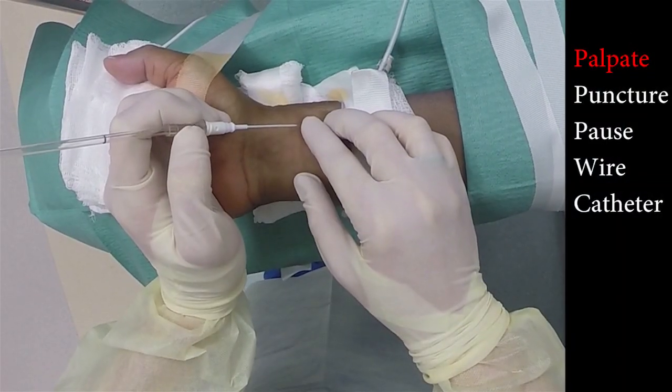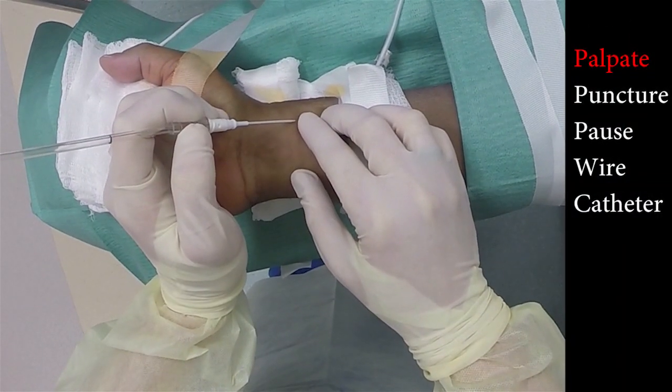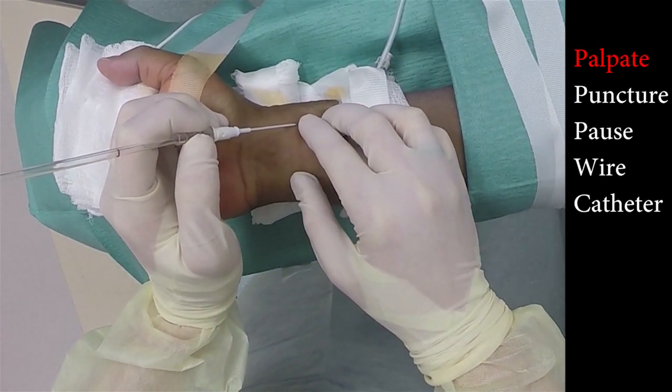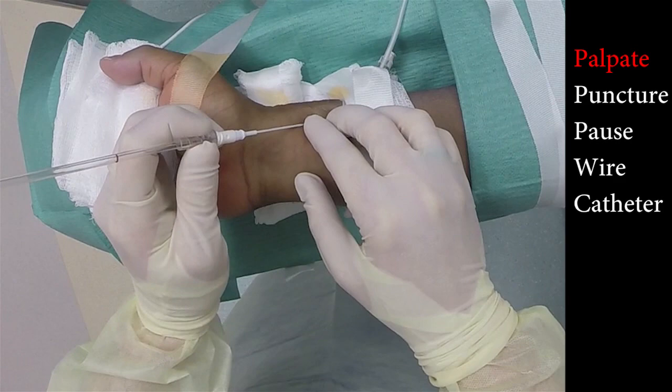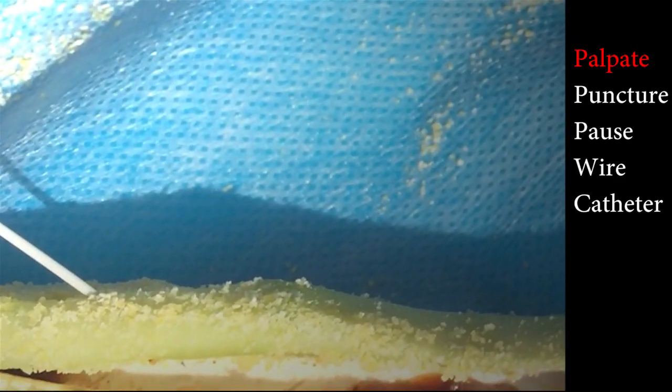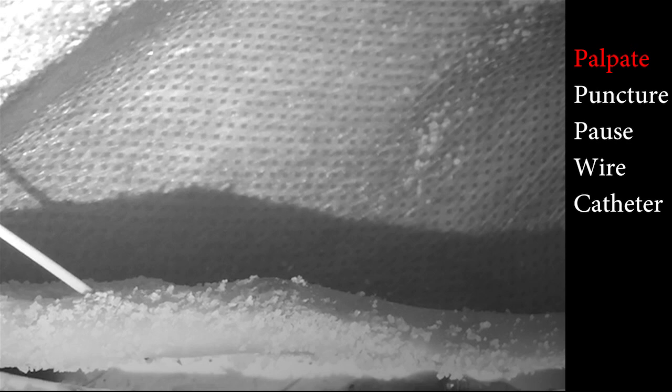Let's now go over the steps of A-line placement. Using the pads of your first and second finger on your non-dominant hand, locate the artery, which has an average diameter of two and a half millimeters. Take your time — this will avoid multiple attempts and potential injury.